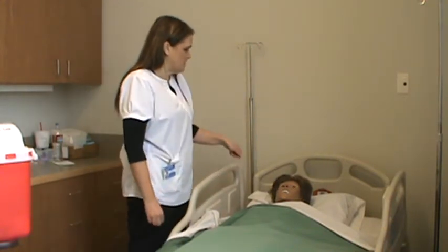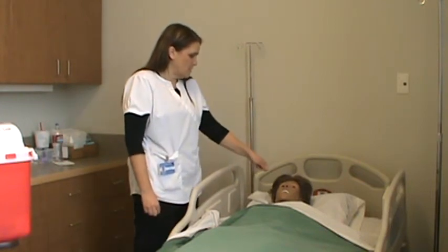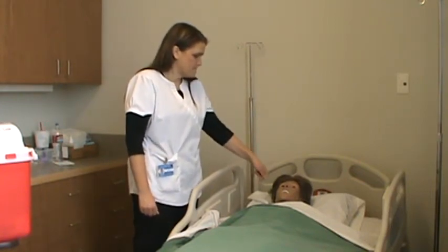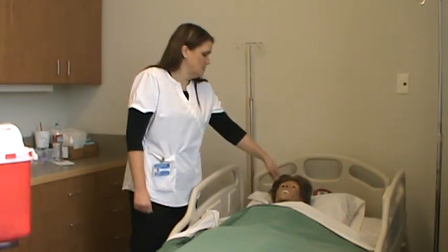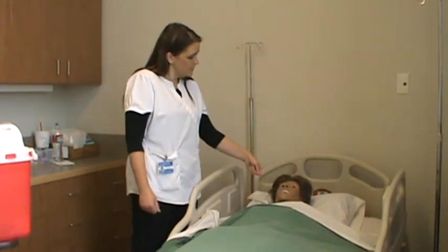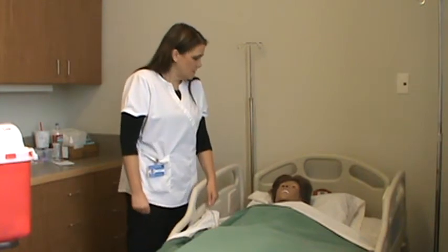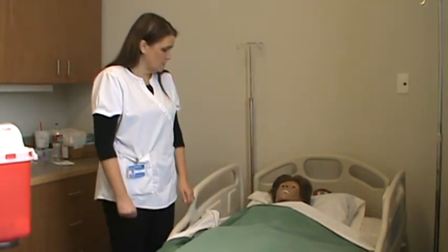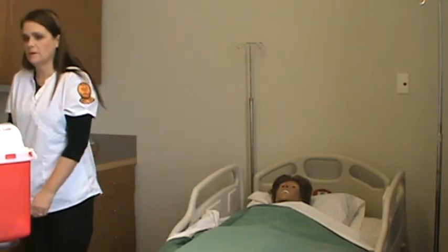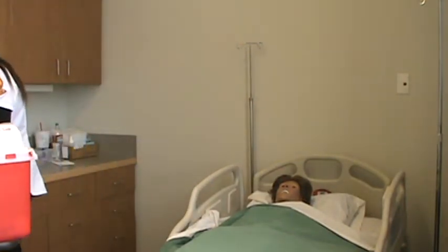At this point, I would assess her temperature to make sure that her temperature was over 101, and it is, it's 102, so she would qualify for the other, but right now I'm just doing my injectables. So I will wash my hands again and pull my medications.